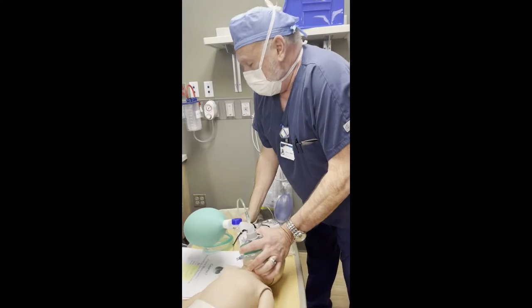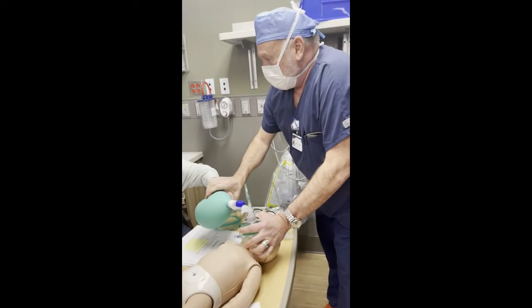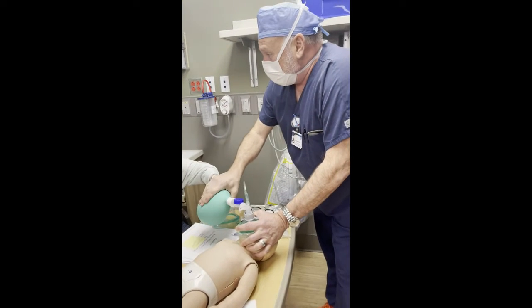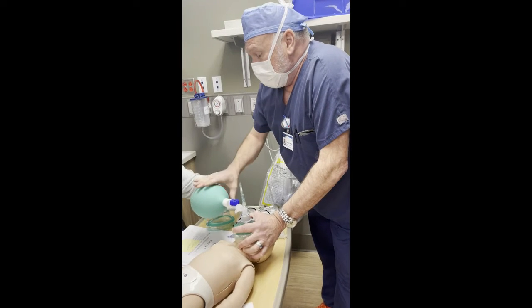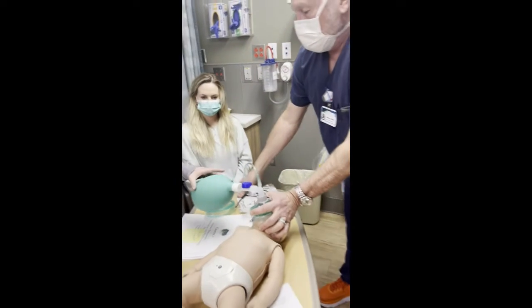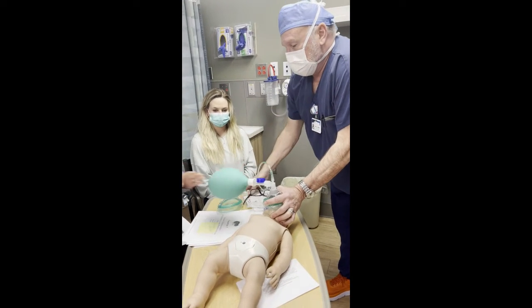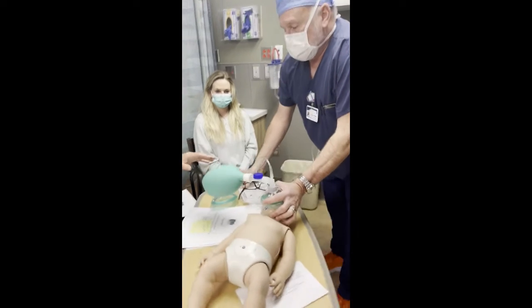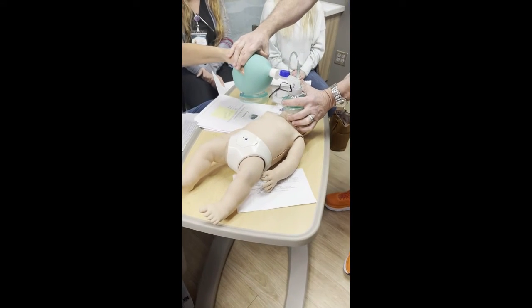So go ahead and grab the bag. You need to hold about that much pressure constantly. Okay, you're not trying to get a breath in because the vocal cords are closed, but you're trying to break that laryngeal spasm with pressure. And you want to hold it about that much. Perfect. There's just constant pressure.